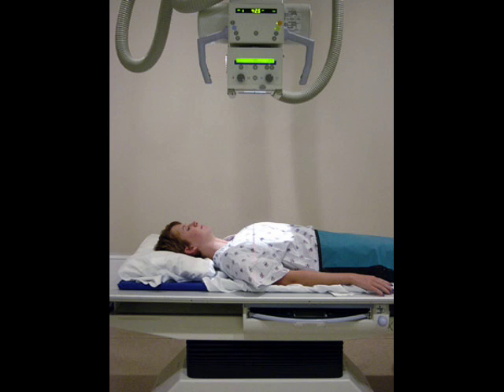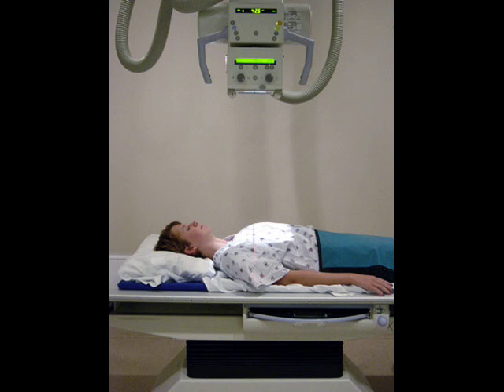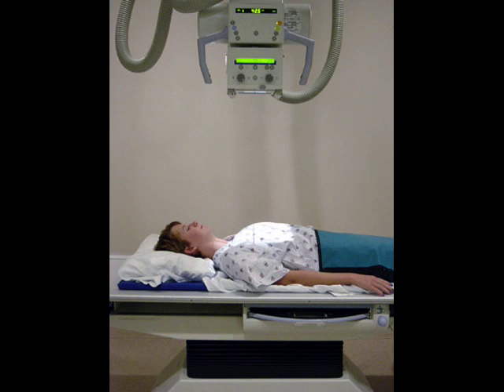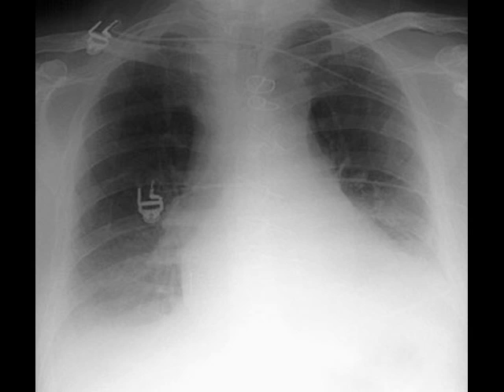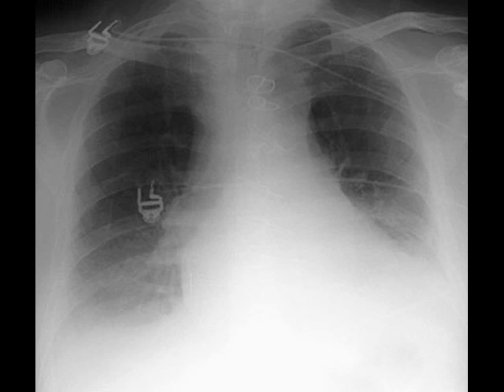More common for respiratory therapists to see is what's called the AP chest, or anterior to posterior chest. This is the type commonly done on patients that can't leave the ICU to go to the x-ray department for their chest film. It's done with a portable machine, which is pushed into the patient's room. Here's an image shot by the AP technique — a portable chest x-ray. Not as good as the PA, is it?